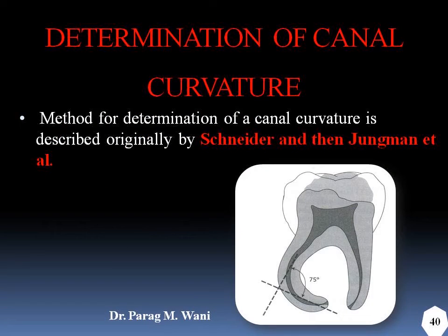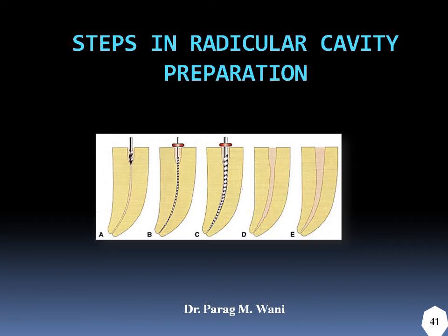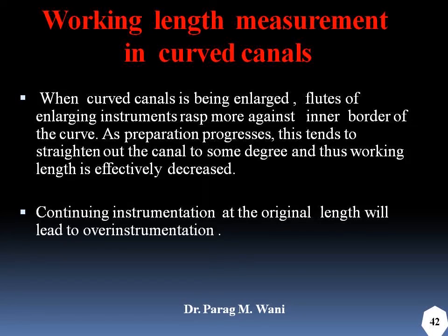After determining the type of curvature and the amount of curvature, we should be taking the following steps to reduce the friction and workload on the file. Whenever doing cleaning and shaping of a curved canal, we tend to straighten out the canal a little bit in the process.